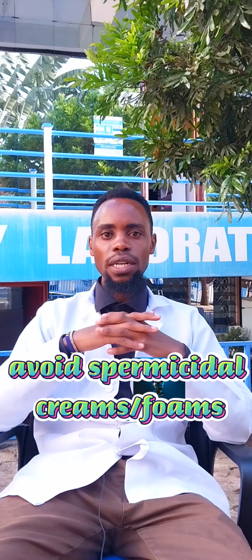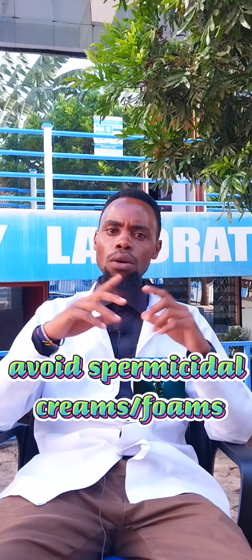Yeah, so avoid using spermicidal creams or foams. Unajua kuna wale watu ambao wanatumia creams fulani pale ambazo zinatumika kuua sperms.